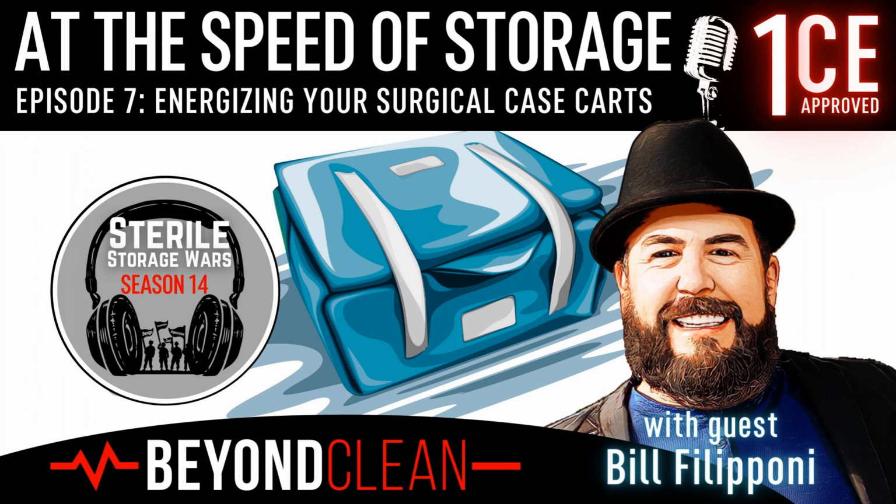Yeah. So, like I said in the beginning, the biggest thing is communication, being able to communicate with your sterile processing team and your OR team. We have a process improvement team that meets, that's the OR and sterile processing team, and we discuss all of these. We do use our tracking system when we pull cases. So we actually scan every tray to that case cart. If that tray was scanned, we know it was on the cart, because it isn't like they typed something in or put a check mark or highlighted a line and said that was there. They actually scanned the barcode on the tray and put it on the cart. Yeah, that data transparency, that's huge.